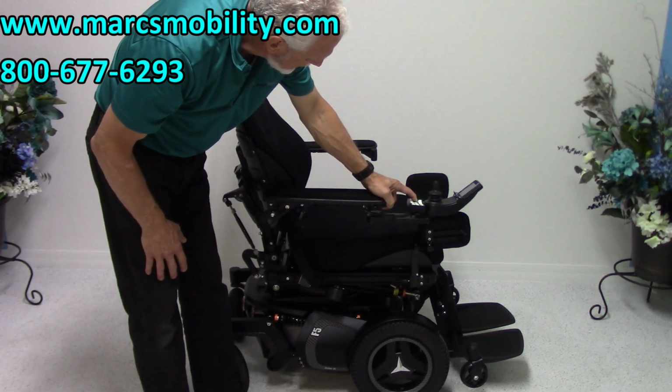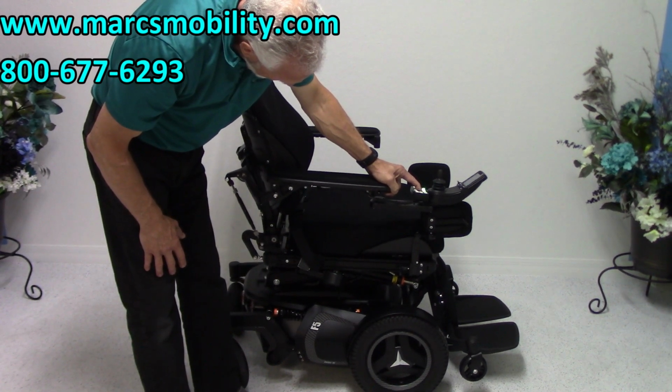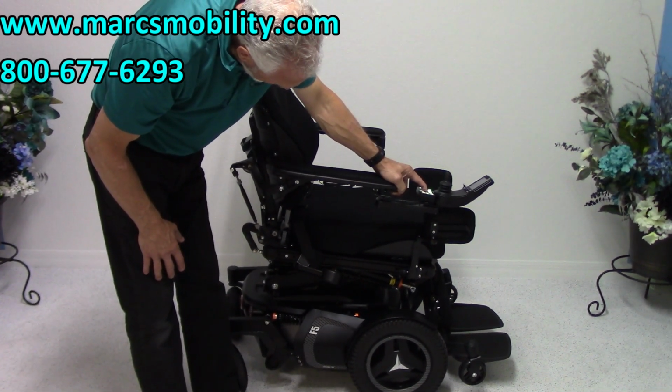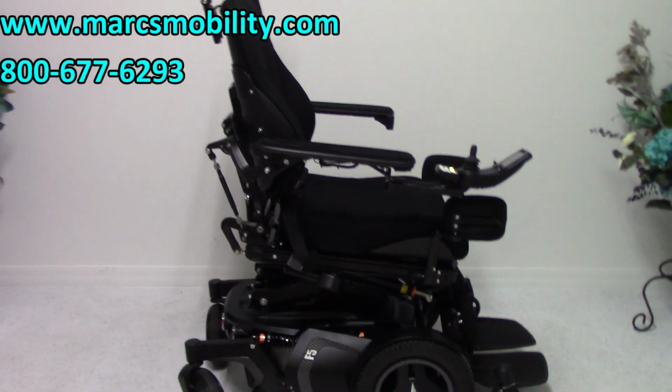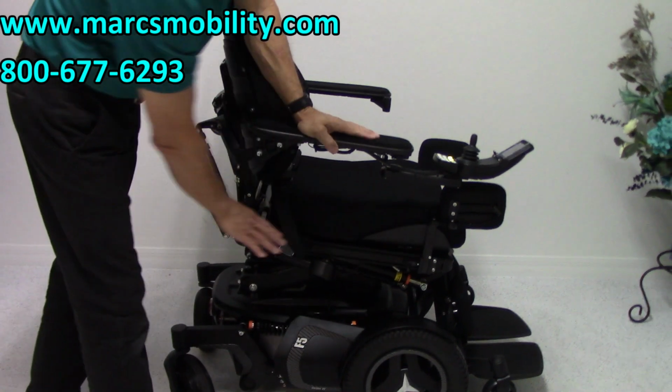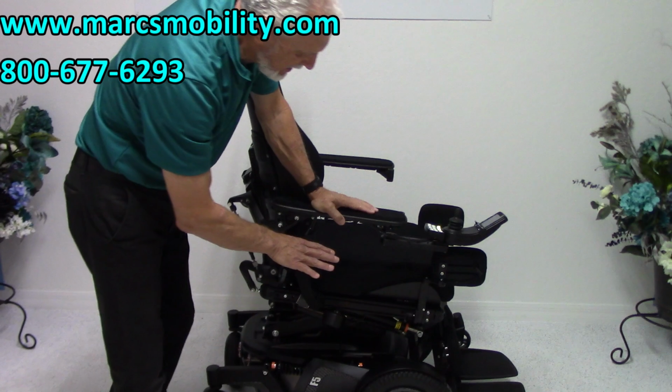Okay, I'm going to raise the seat up a little bit. This is called the anterior tilt. I don't know if you've seen it right there. So right there we've got about a 10-15% tilt forward. That's called the anterior tilt. It kind of helps you get out if you needed to get out.